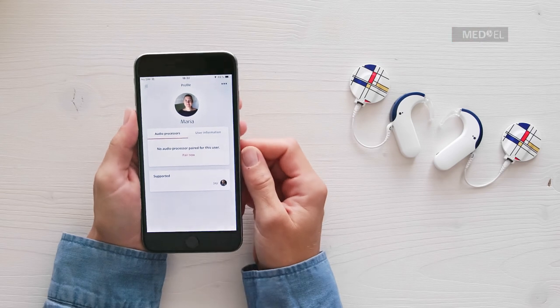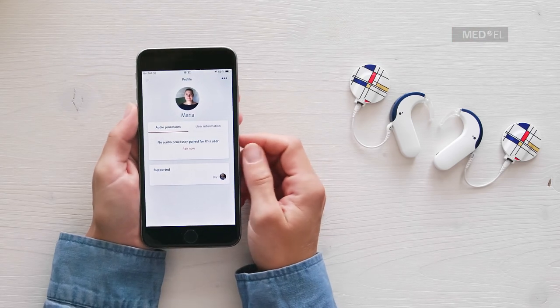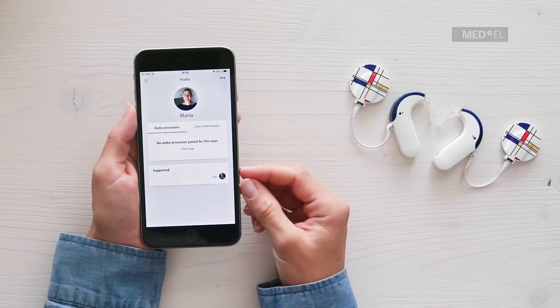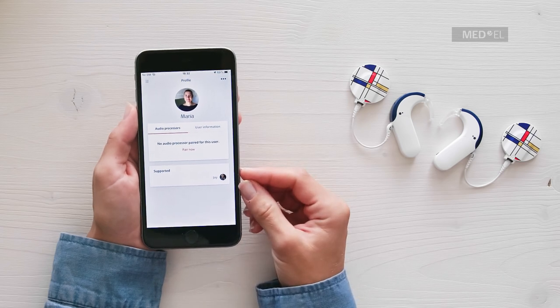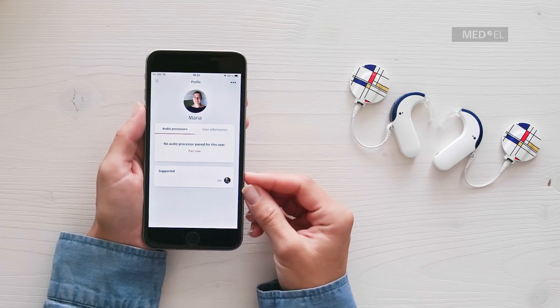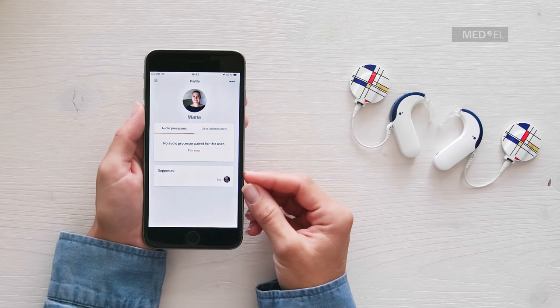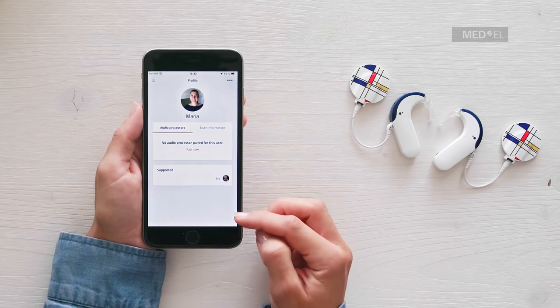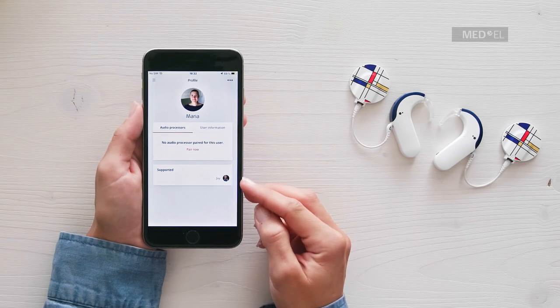AudioKey's guardian roles allow you to control audio processors belonging to your child or another person you look after. You can be a guardian for multiple users. For example, parents can use a single phone to control the audio processors of all their children, and teachers can control the audio processors of multiple CI users in their class.